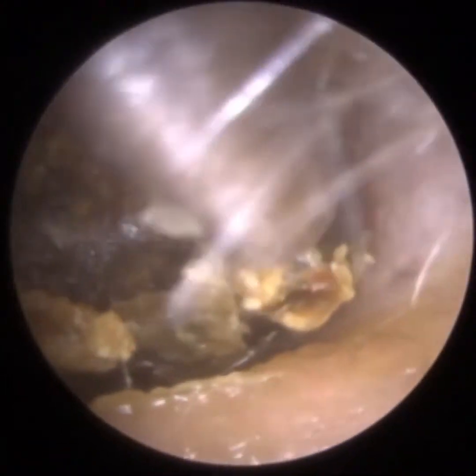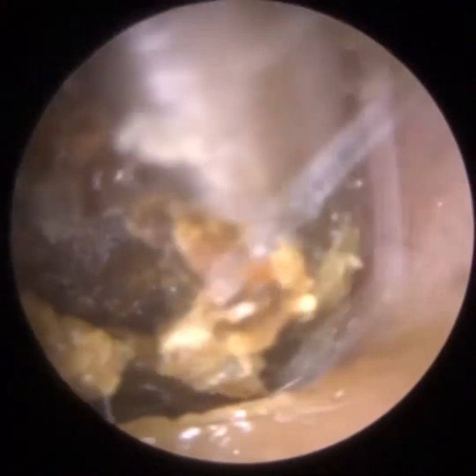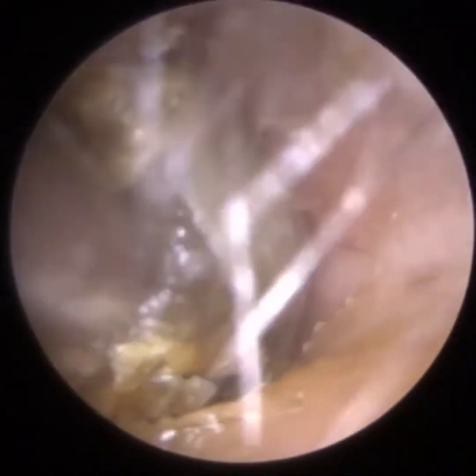So I've just used the ear hook again. Now sometimes with an ear hook, you don't always try to remove the wax with it, you're just trying to disrupt the plug of wax, break it up, almost like a hammer and chisel, into little pieces, and then go back in with a suction probe.